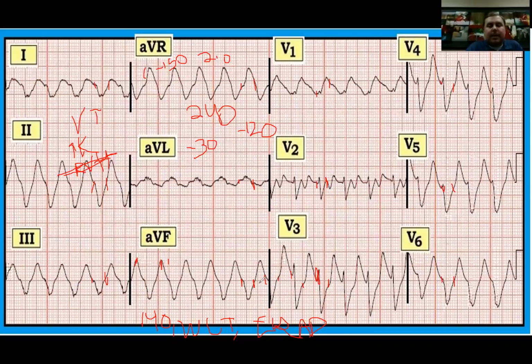And what that means is I give that trial calcium, I'm going to hit another 12 lead, and I'm going to see if my QRS narrowed at all. If it narrowed, then I'm going to keep giving calcium until I get them out of this rhythm. If it doesn't, then I might start considering shocking first and then starting an antidysrhythmic after that.